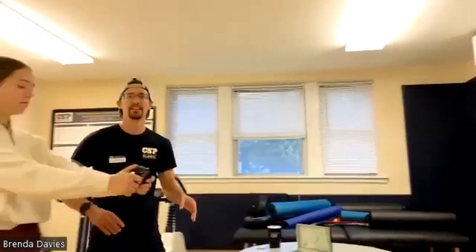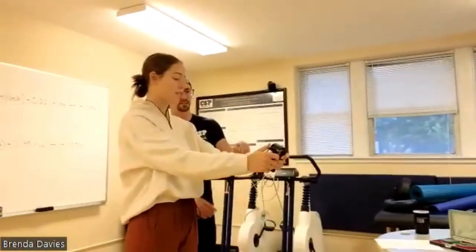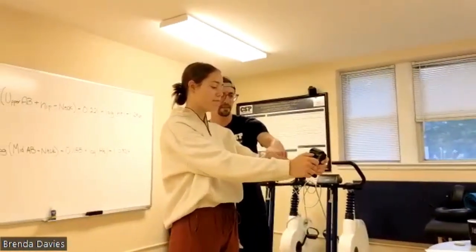So okay, I set this up with all the information specific to Anna. What she's going to do is grab onto these two pads and then hit start. And then hold on to that. There'll be a little flashing light that will start to propagate from low, normal to high, and then it'll give you your body fat percentage, and then it'll also give you your BMI. So if you want to just do that, I'll just stand over here so that you can see.